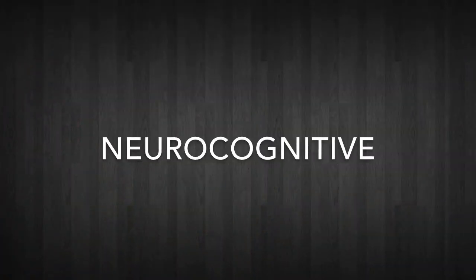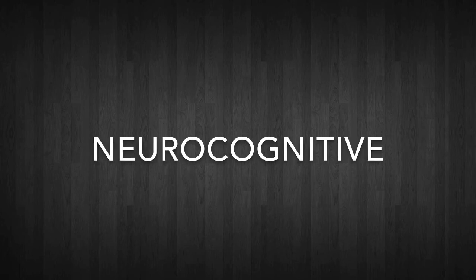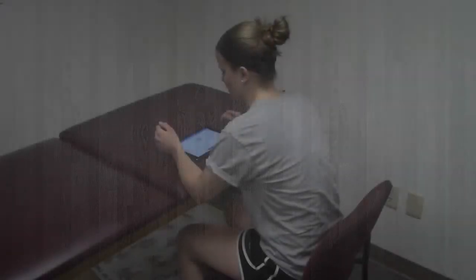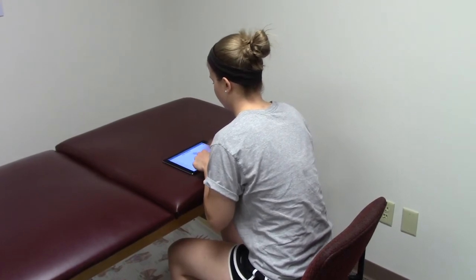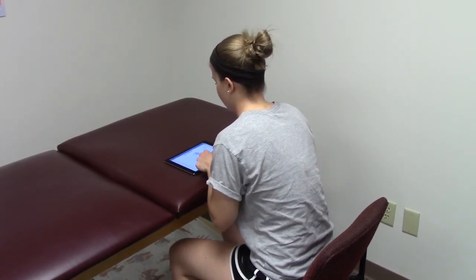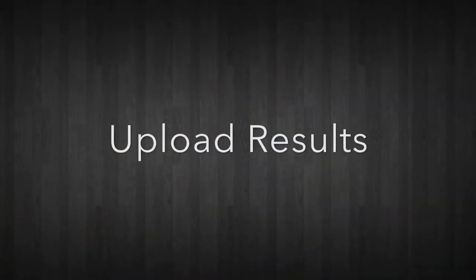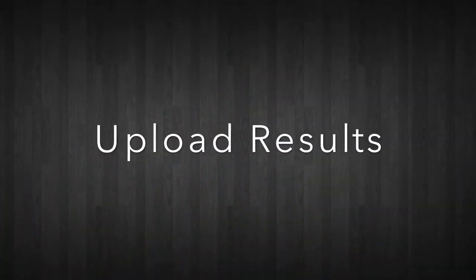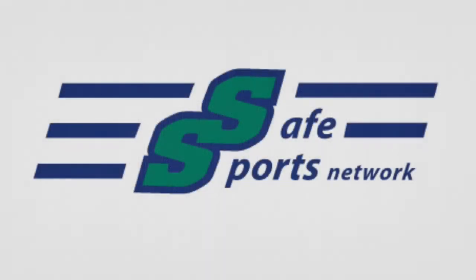The last part will be the athletes performing a series of neurocognitive tests. They will be put into a quiet area, and your job will be to make sure they read the instructions carefully, ask any questions if they are unsure how to do a section, and to collect their iPad once they are finished. Once the iPad is collected, a Safe Sports Network staff member will review the results and upload them to the testing server cloud.